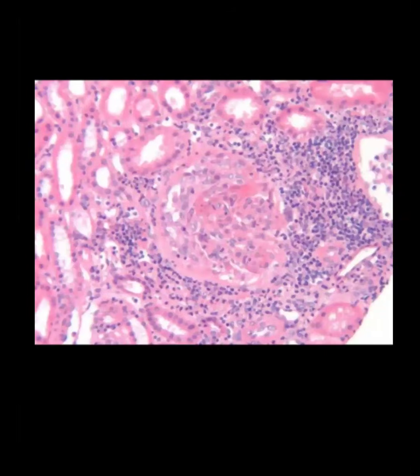So what is this? Interstitial inflammation and the crescent as well. Crescent as well as severe interstitial inflammation. Severe interstitial inflammation occurs in acute interstitial nephritis, chronic interstitial nephritis, Balkan endemic nephropathy, aristolochic acid nephropathy, IgG4 related disease, as well as cell mediated rejection, and sarcoidosis. The tubules are back to back, so it is not ATN.